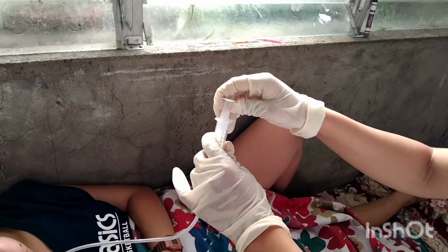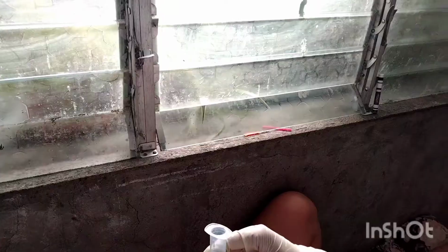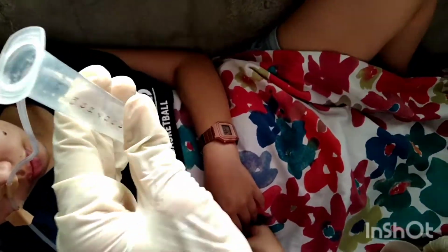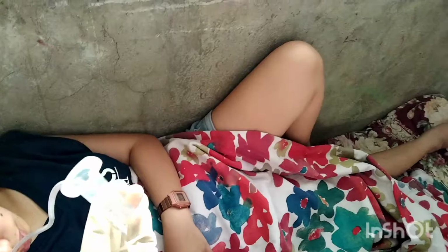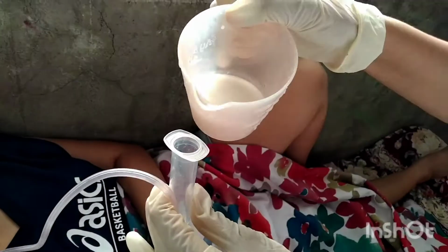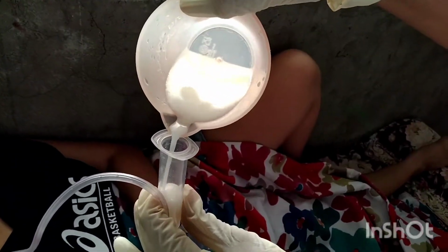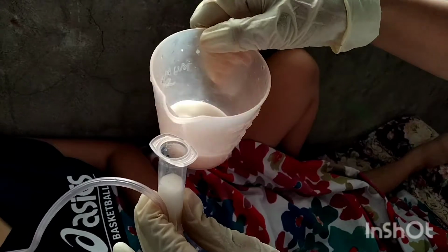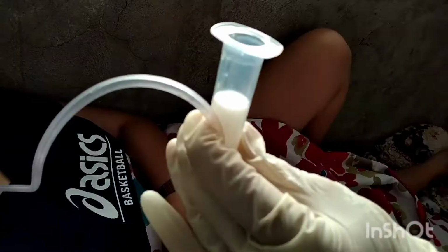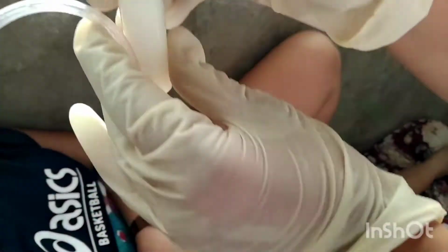Procedure number 6, initiate feeding. Bolus or intermittent feeding: pinch proximal end of the feeding tube. This prevents air from entering the client's stomach. Remove plunger from syringe and attach barrel of syringe to end of tube. Fill syringe with measured amount of formula. Release tube and hold syringe high enough to allow it to empty gradually by gravity. Refill, repeat until prescribed amount has been delivered to the client.